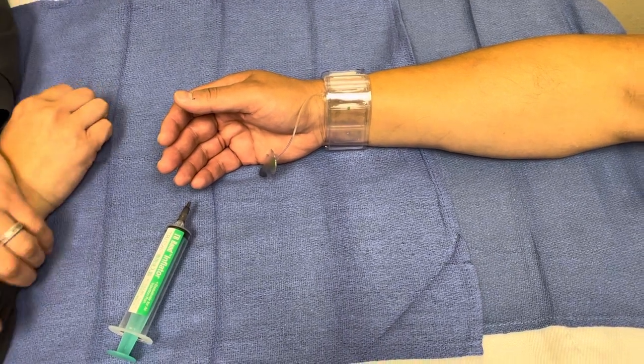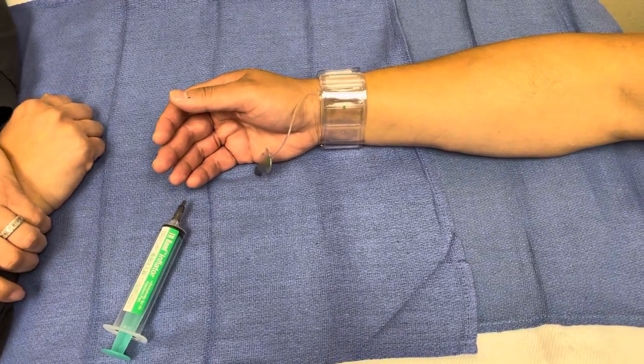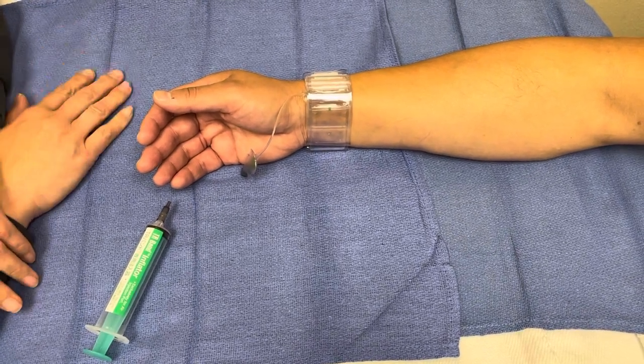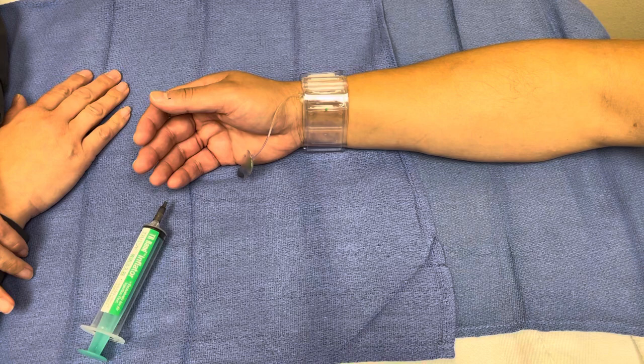Nicole from the cath lab. I'm the educator and assistant director here at UMC. We're going to go over how to take the TR band off per policy and procedure of UMC.